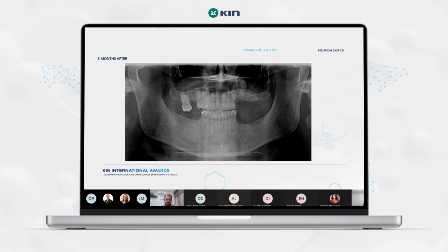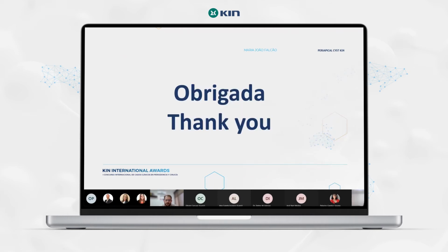So we will wait a little bit more for the healing, maybe 5 more months. So we have a total of 8 months between the extractions and the bone graft. And we will perform another 3D exam so we can plan the implant surgery. And well, after that, the crown, so we can have function again. Obrigada.